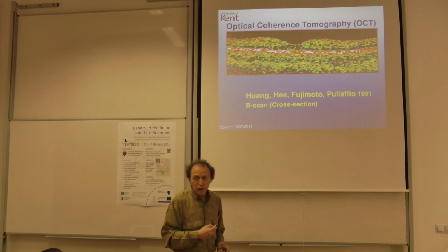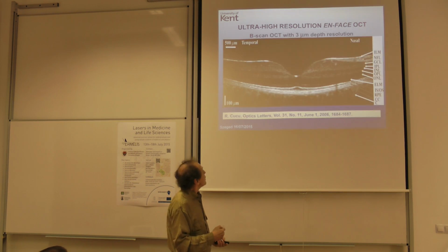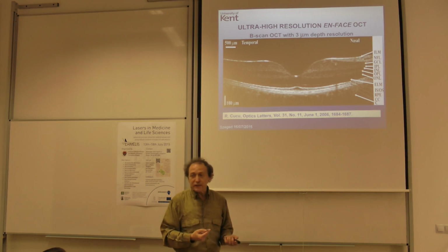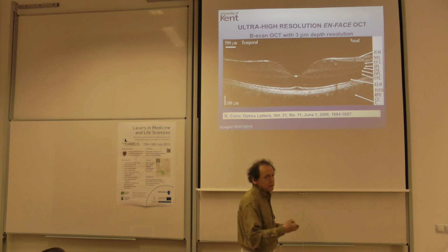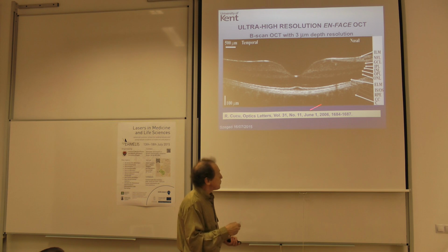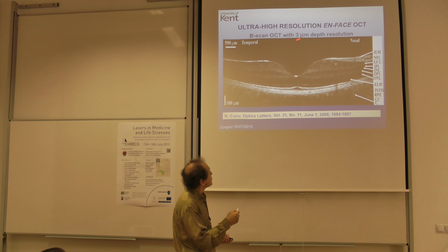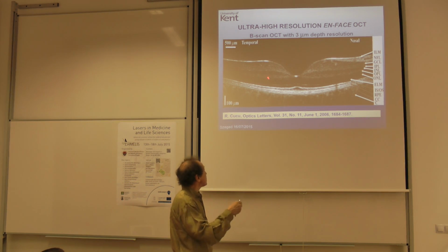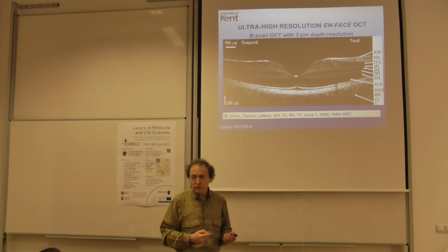That was one of the first images produced. That's axial depth, that's lateral. Compare, please, with the advance in technology. That is one of our images now, and that's why ophthalmologists now use OCT in their current practice: with an undilated eye, you don't need to dilate it, with power which is safe, less than 1 milliwatt sent to the eye, you can get an image with 3 microns depth resolution. This is in fact an exquisite realization which we published, where we achieved 3 microns in the living eye.